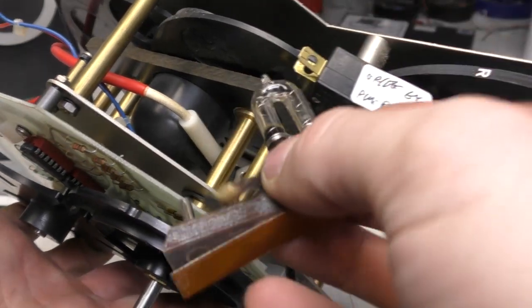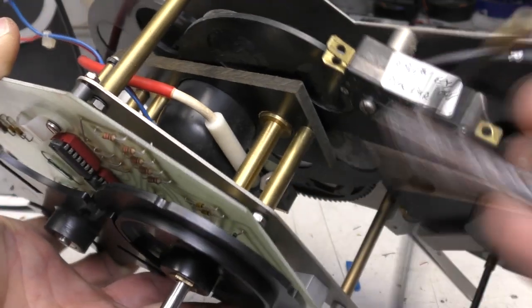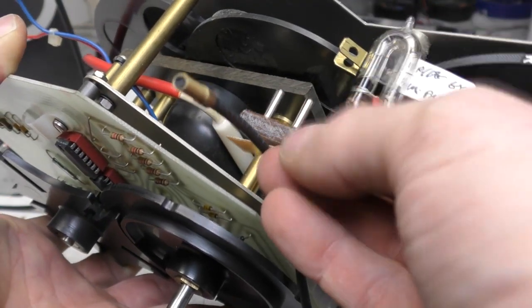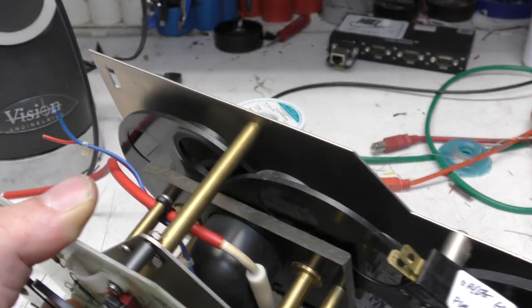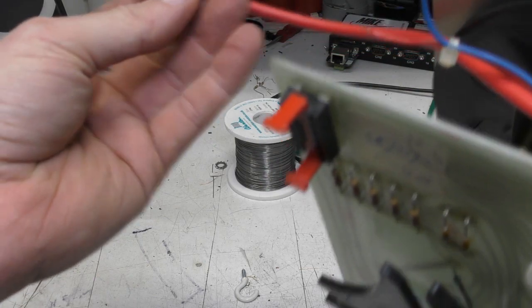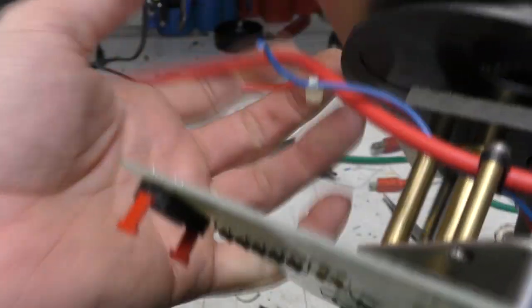Sometimes you also get conductive paint around the tube to capacitor couple an impulse to ionize the gas. The best way of doing that is actually locate the trigger transformer really close to the flash tube, otherwise you've got this very high voltage signal going down this sort of quite long wire, which is very bad for EMC, and there's scope for all sorts of insulation breakdown and so on.